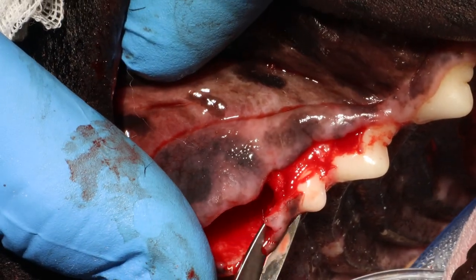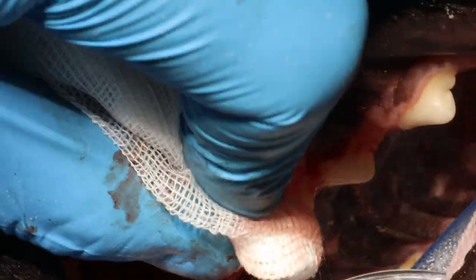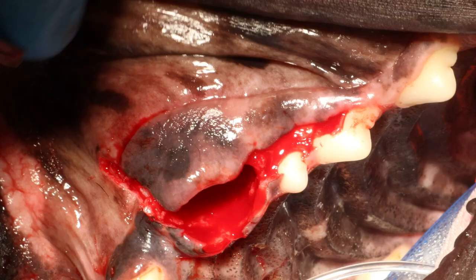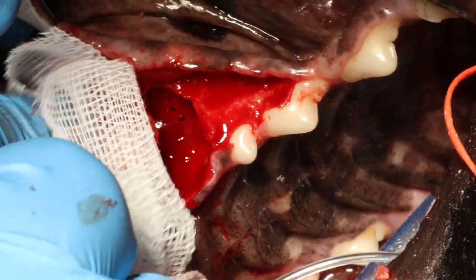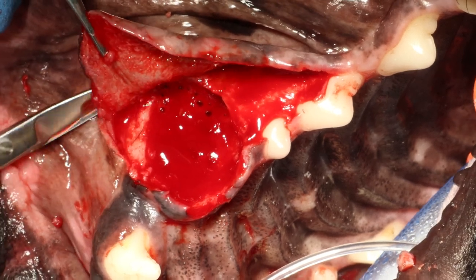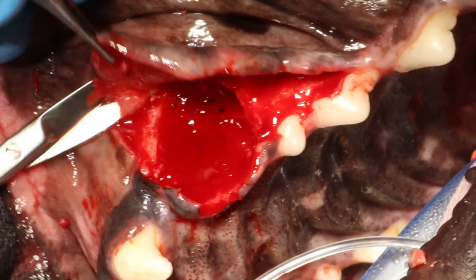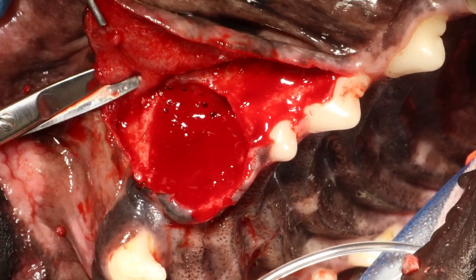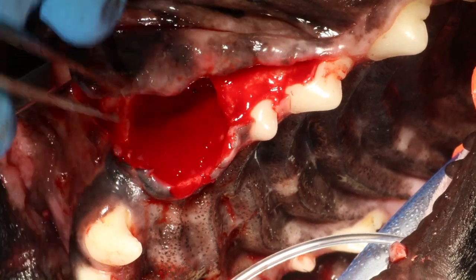I'm using scissors to debride the edge to make it ready for suturing — this is a curved scissor. I want to release the flap a little because it is slightly pulling back when placed onto the alveolus. You want the flap to stay where you put it; if it pulls back you need to release it. I go to the corner, open up, and release — you can see the white inner part, which is the periosteum. You want to go between the periosteum and the mucosa, put in the scissor and cut. You get a lot of release with this technique. Then check on the outside that you are not accidentally poking through.